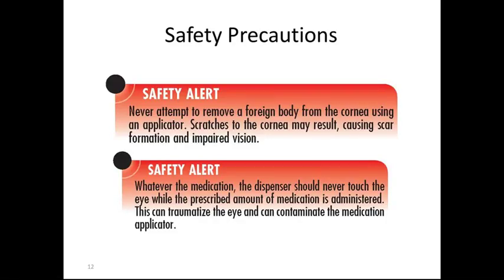Safety precautions. Never attempt to remove a foreign body from the cornea using an applicator. Scratches of the cornea may result and cause scar formation or impaired vision that is irreversible, unless you have a corneal transplant.